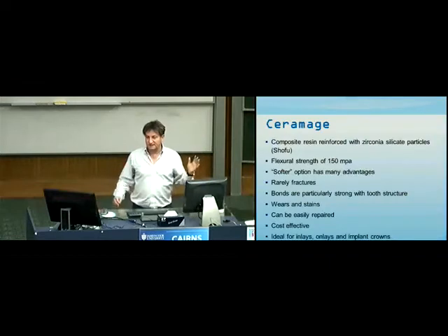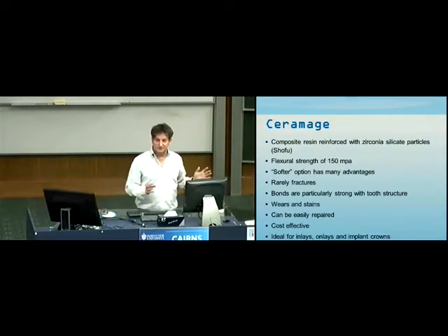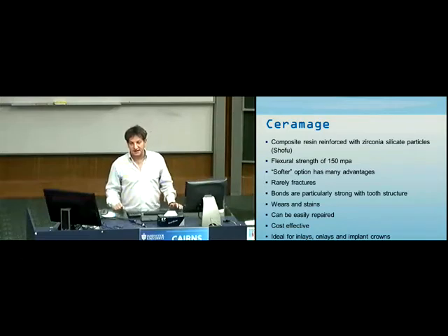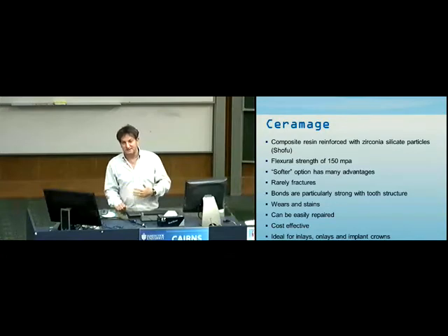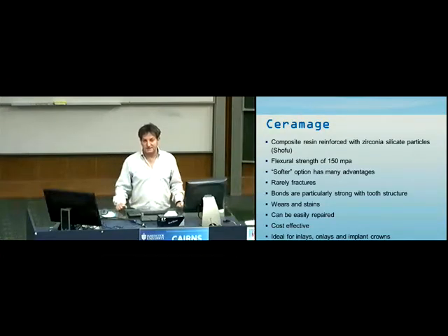Now, I'm going to start talking to you a little bit. I'm going to go through the softest materials through to the hardest materials. And I want you to try and understand where I'm coming from here. I'm a dentist who graduated in 1978, so what's that, 34 years ago, it's pretty scary stuff now. I remember when I first graduated I did PFM crowns in the first year or two, and I probably didn't have much of an idea what I was doing. I had a guy working next to me who helped me a hell of a lot.